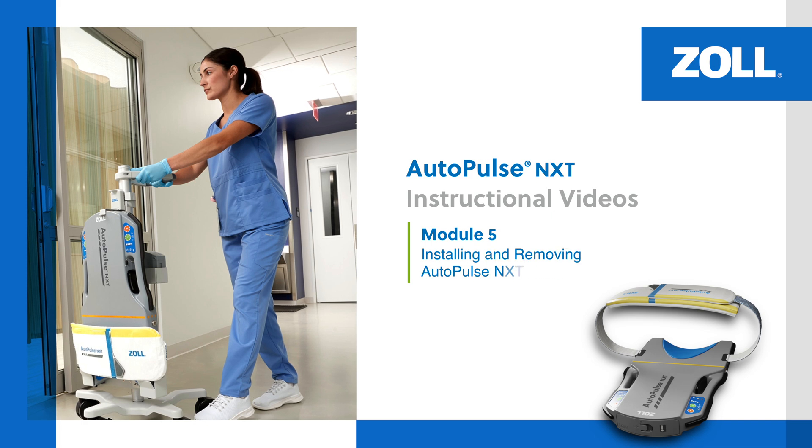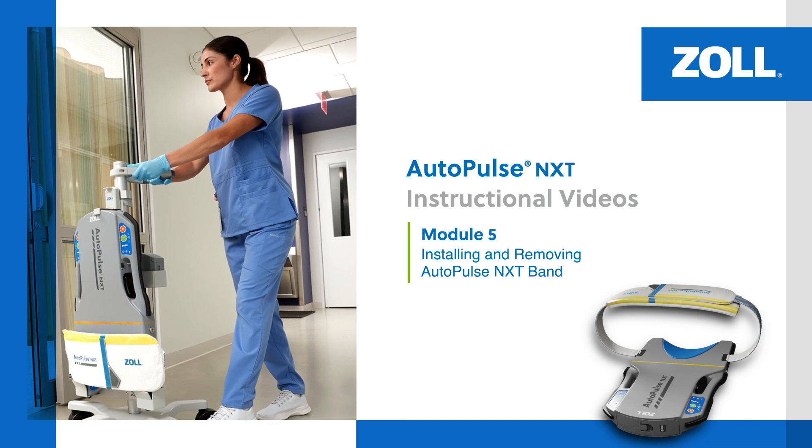In this module, we review how to install and remove the AutoPulse NXT band.